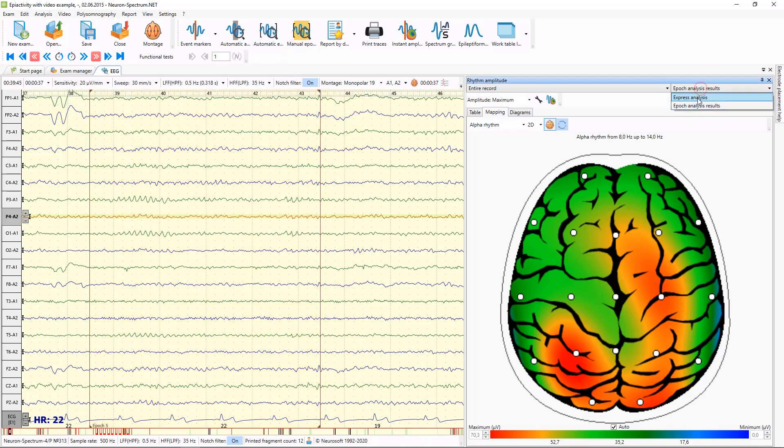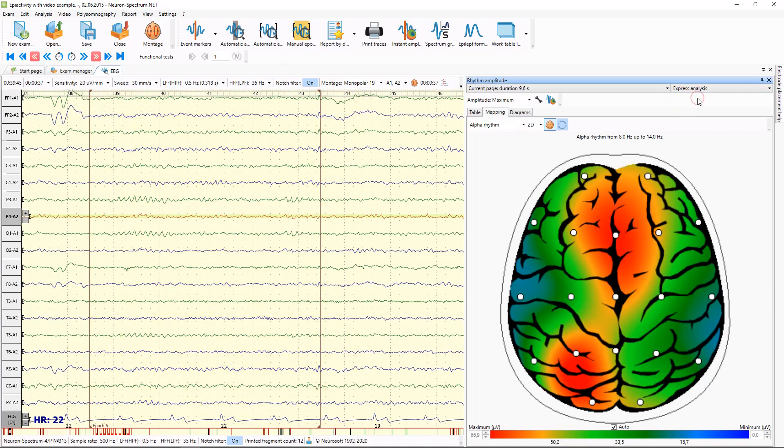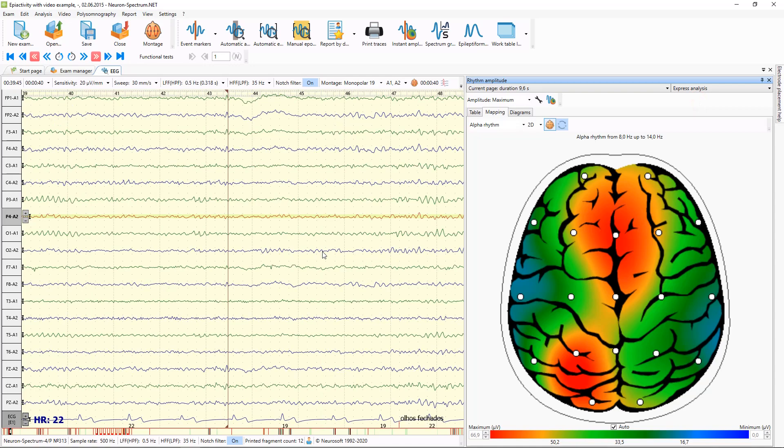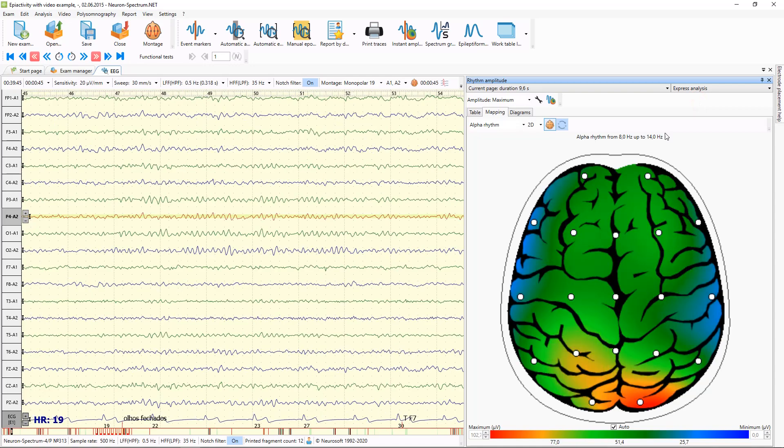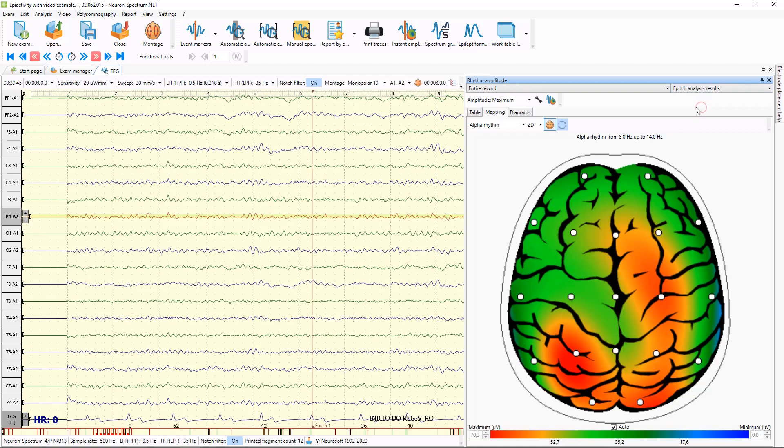And you can switch between Express Analysis and Analysis of Epochs.